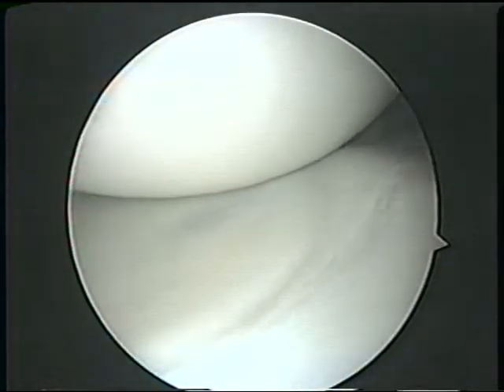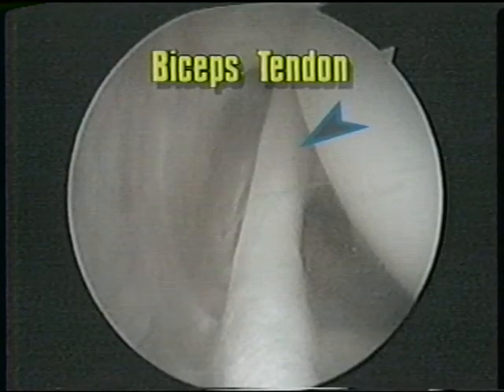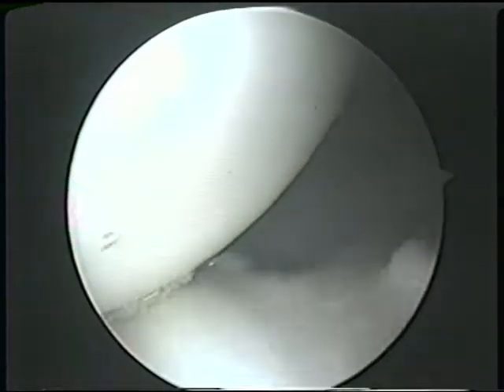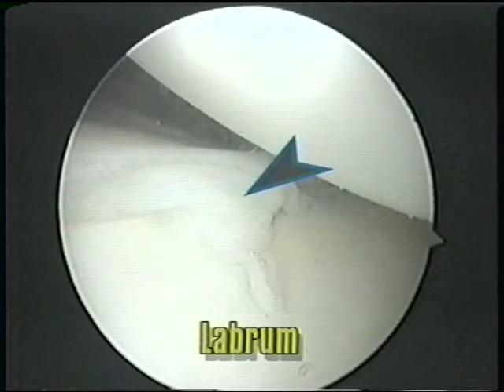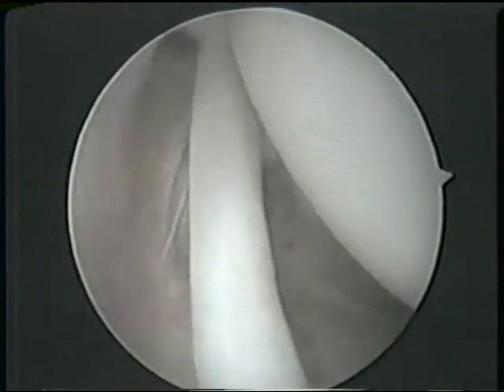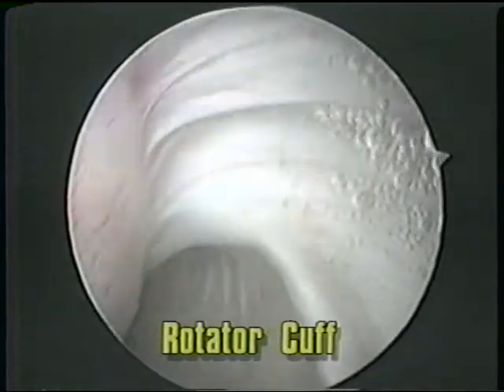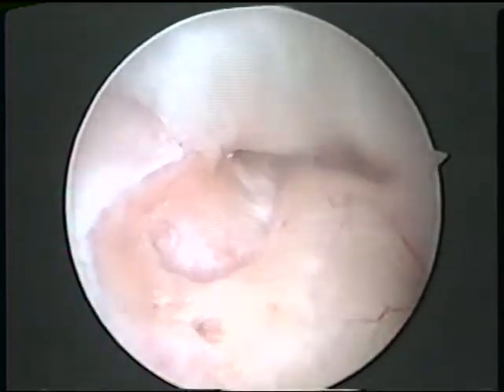Once the arthroscope is in place, the first structures we look at are the humeral head, or the ball, the glenoid, or the cup, and the biceps tendon. We look to see if the ball is spherical, or if there is any damage to the cup. Then we look at the labrum, which is the soft tissue that may be torn from the cup when the shoulder is dislocated. Also, we note the biceps tendon, which can be involved with tendonitis. The rotator cuff tendons are also inspected to determine whether a partial or complete tear may be present.